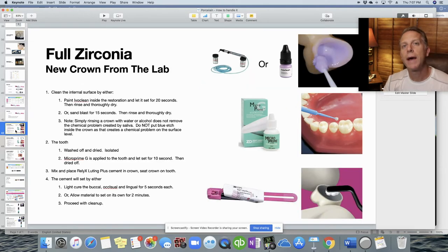For a new full zirconia crown from the lab: clean the internal surface either by painting IvoClean on the inside or sandblasting for 15 seconds — you simply can't just wash it with water. Then wash off the tooth, isolate, apply Microprime G (our glutaraldehyde-based desensitizer), mix up the Relyx cement, put it in place, tack cure, and wait for the initial self-cure.